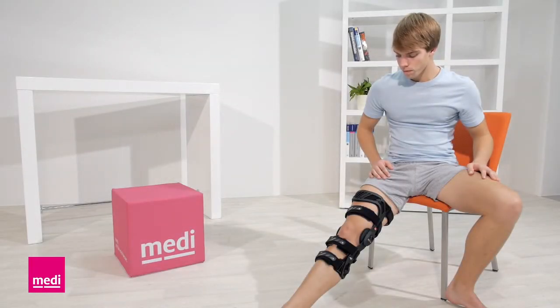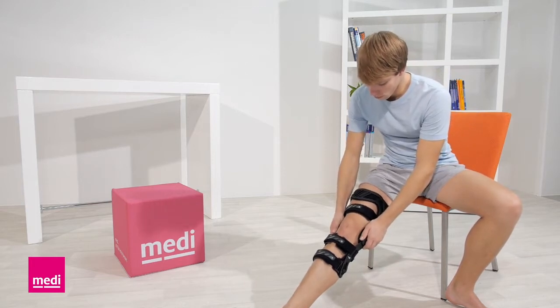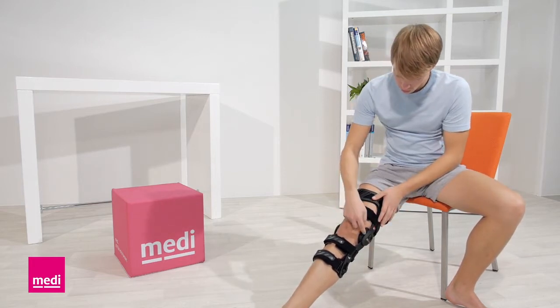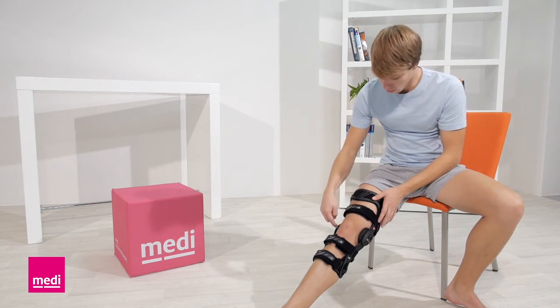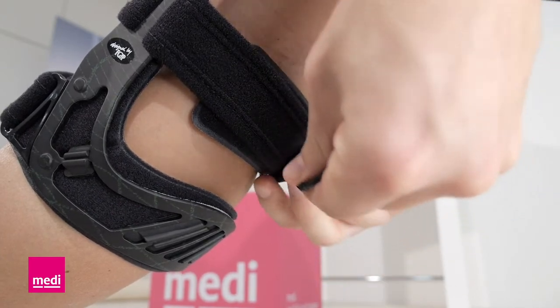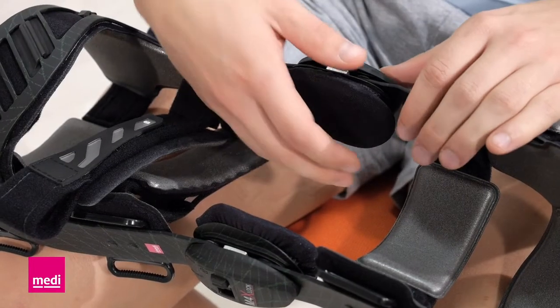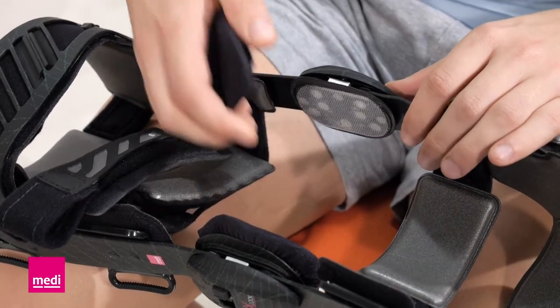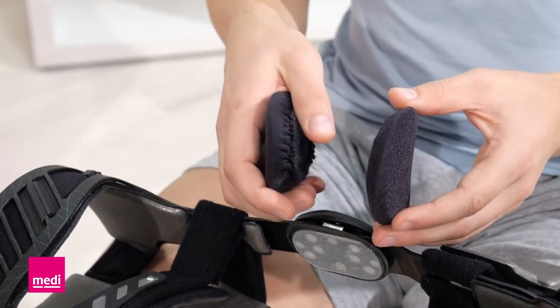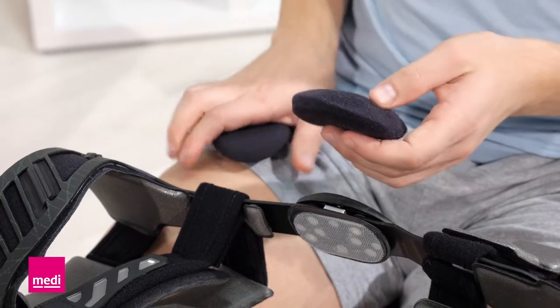If the orthosis does slip, please check that the orthosis hinge is correctly positioned at the level of the superior border of the kneecap. Check the position of the calf strap number 5. This should cross above the widest part of the calf muscle. Add padding to the inner surfaces of the knee hinges using the extra padding supplied with the orthosis. Wear the orthosis directly next to the skin whenever possible.